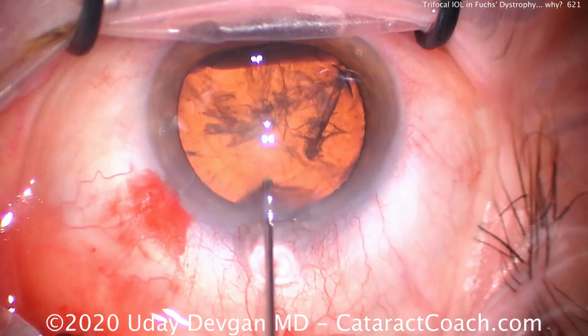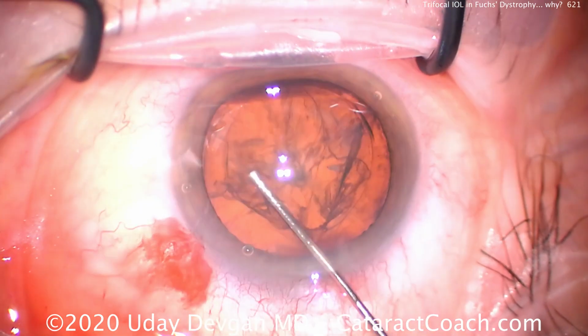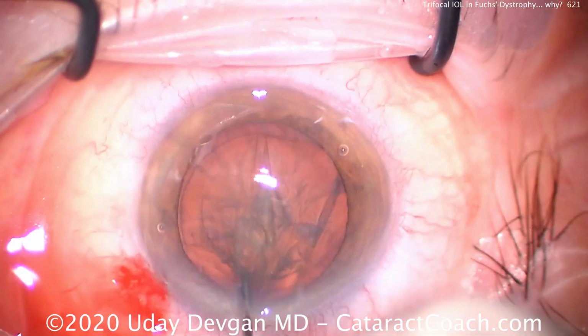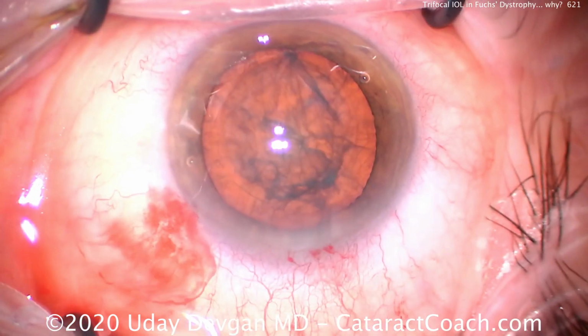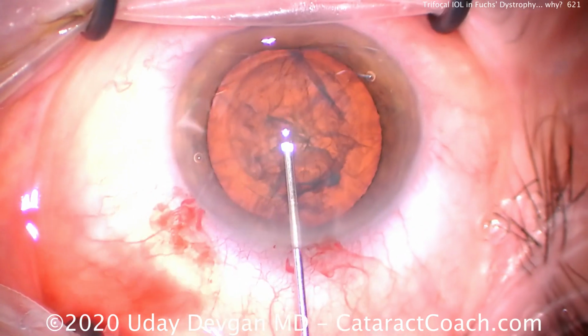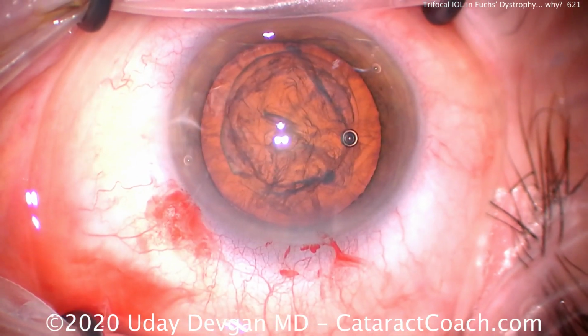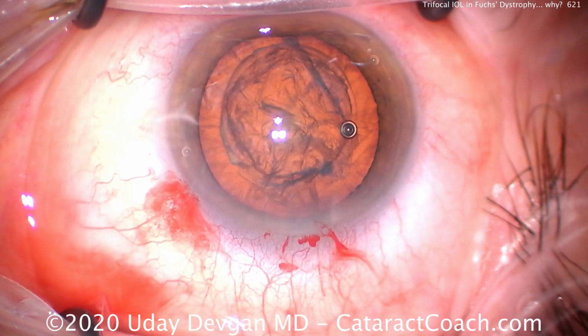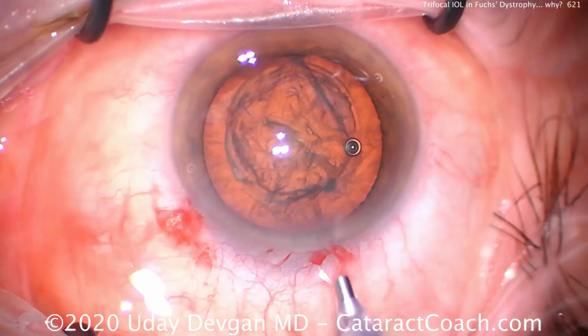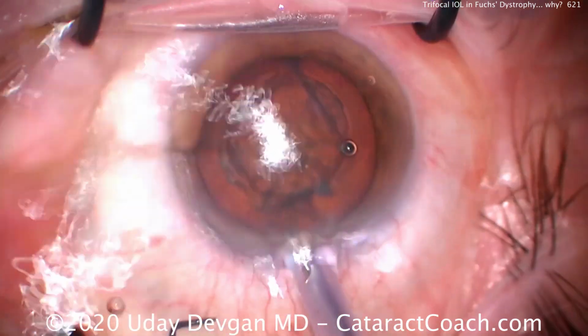We've made our phaco incision here at 90 degrees superiorly because the patient has a little bit of astigmatism there that we want to neutralize with our phaco incision. So we'll finish up hydrating the lens, doing hydrodissection, and now we're going to put in some extra viscoelastic, very important, more dispersive viscoelastic. We want to protect the corneal endothelial cells as much as we can, and we're going to operate within the capsular bag.